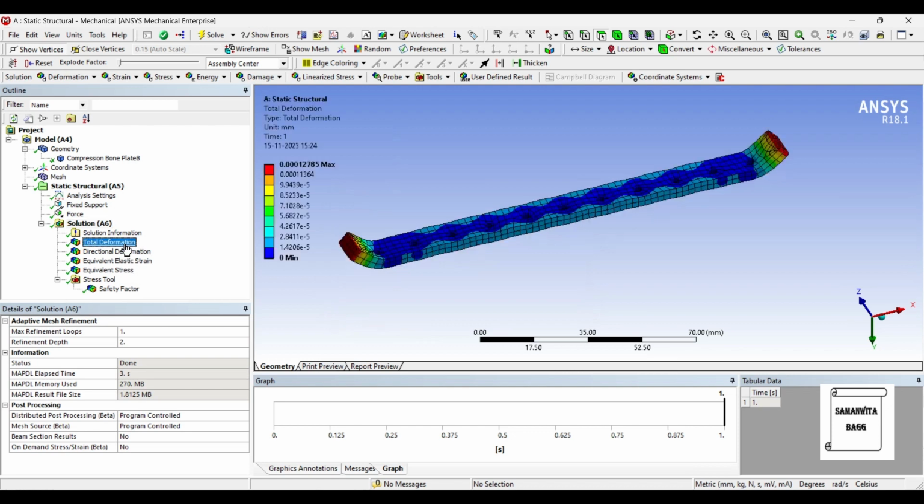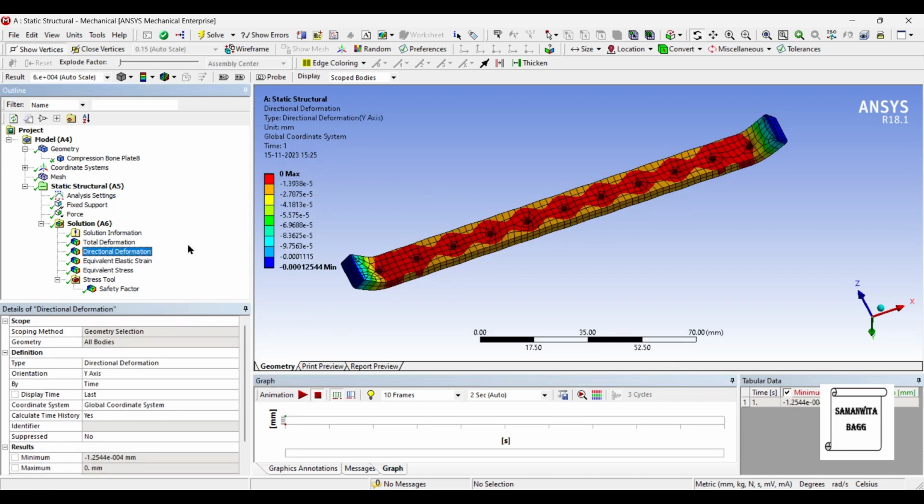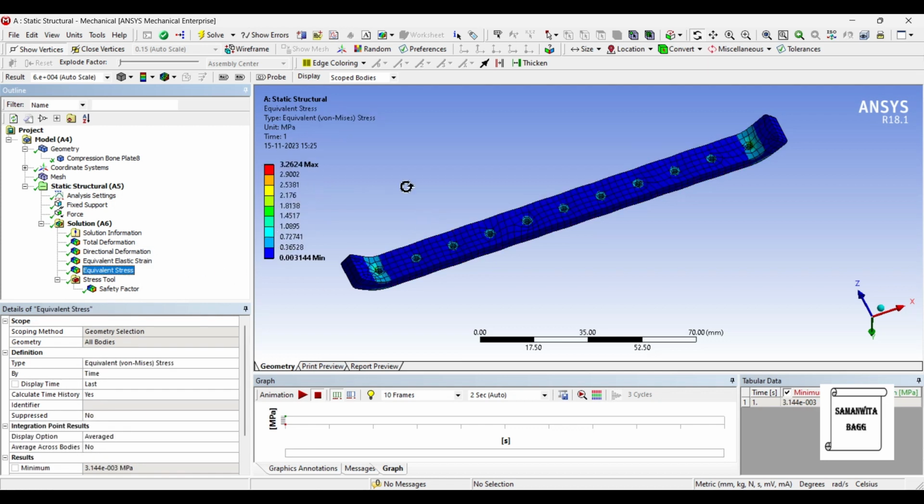I am interested in seeing the total deformation, which is again very less, 0.00127 mm. It's a very low value, as you can see. Directional deformation is also seen here. These values will be little higher as compared to the previous solution. The reason is we have increased the force applied on the plate. If you check the stress, it is 3.26 megapascal, but the material is stainless steel, if you understand.